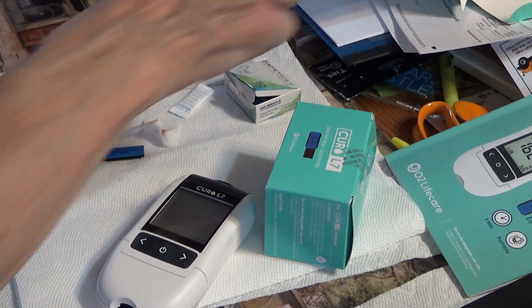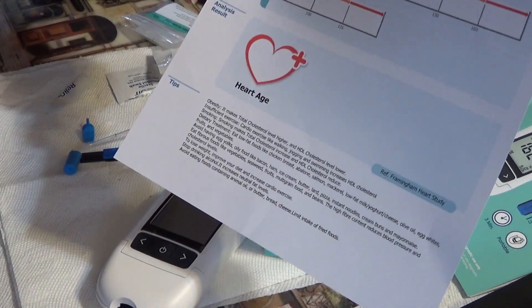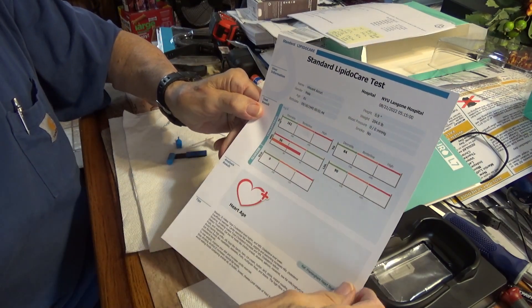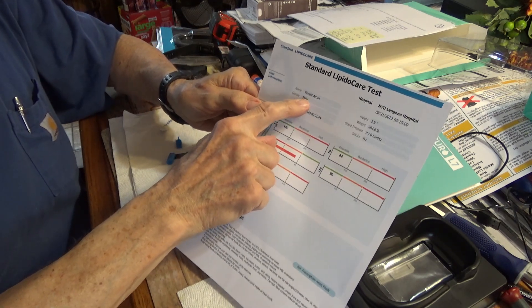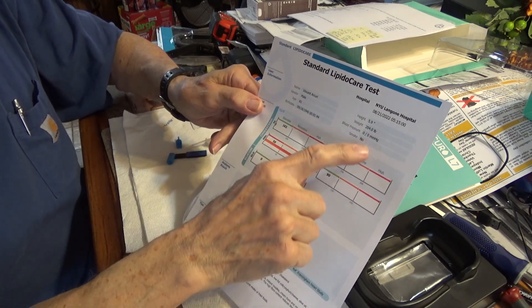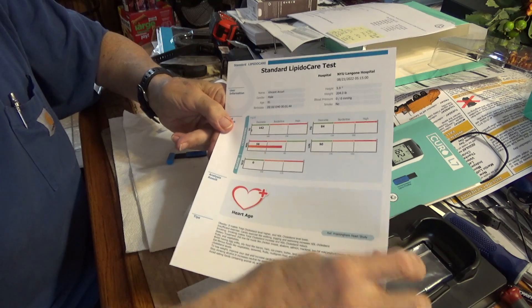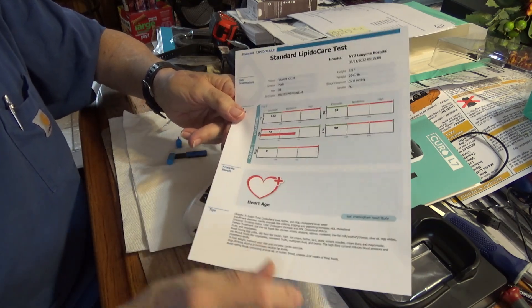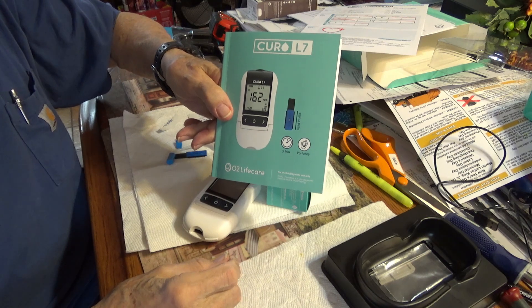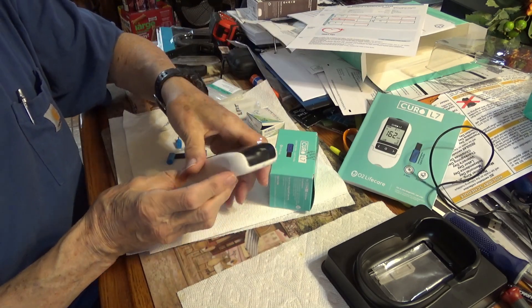Now I'm going to show you about the software. Here's a printout from yesterday. That's yesterday's printout — got my name, male, 81 years old, date of birth, my weight right now 204. Pretty cool. The manual does not say about downloading any kind of software, but it does show you that there's a printer port in the back.